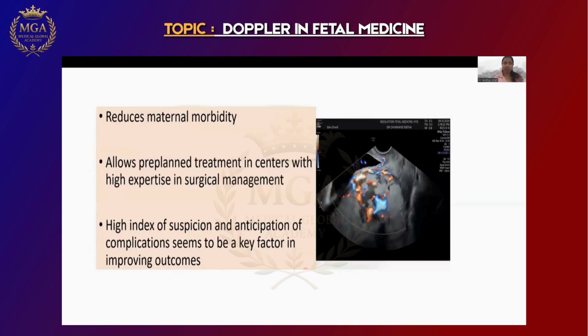Many times, I think a month back, a patient came with APH and she was not diagnosed as placenta accreta, and that was a 30-week scan I did. It was a placenta increta. I went for cesarean for that, and we had to do a hysterectomy with bladder repair for the patient. And she was not even told that she had such kind of condition. Therefore, put a Doppler behind the placental bed, specifically in cases of low-lying placenta or previous cesareans, so that we can help the mother.